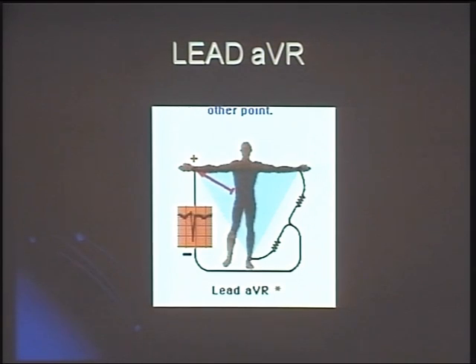In this way, they recorded AVR. So AVR, in a simple way, look at the lead systems as your cameras. The camera is looking at the various surfaces of the heart. My right-sided AVR camera is looking at my right superior surface. From the right superior surface, I am looking at my heart. That is my AVR camera. So AVR is looking at the right superior surface of the heart. So I know what is coming towards or going away from my right superior surface.